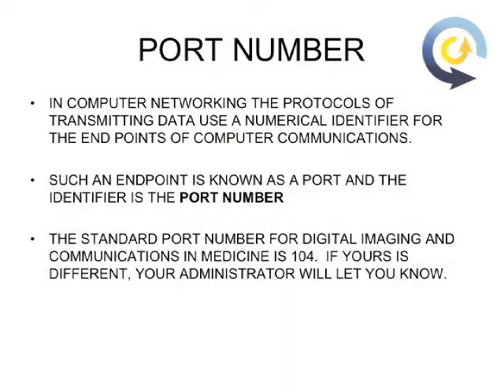Port number. In computer networking, the protocols of transmitting data use a numerical identifier for the endpoints of computer communications. Such an endpoint is known as a port, and the number is the port number. The standard port number for Digital Imaging and Communications in Medicine is 104. If yours is different, your network administrator will let you know.